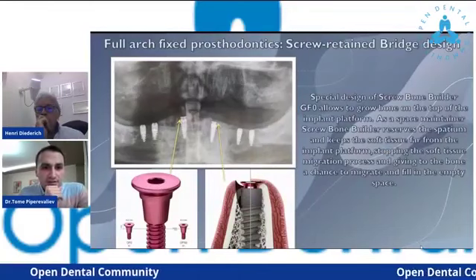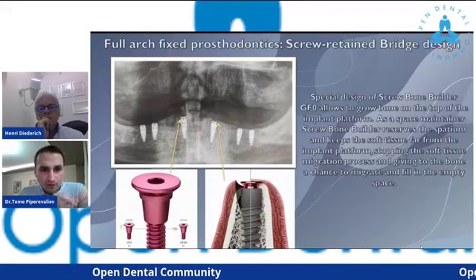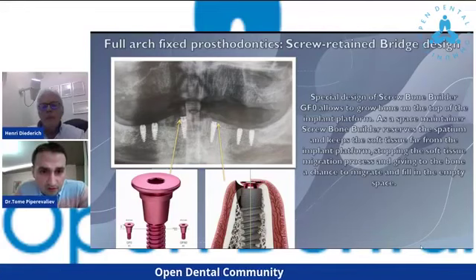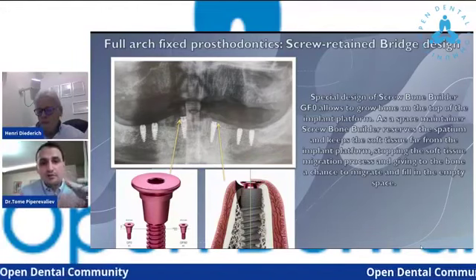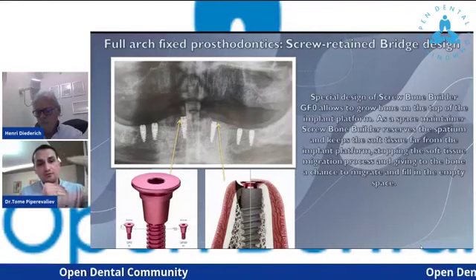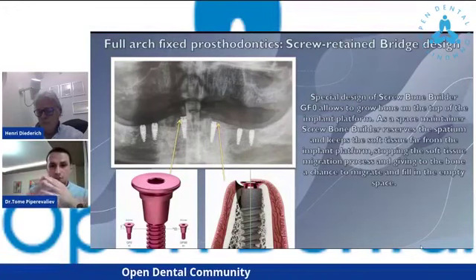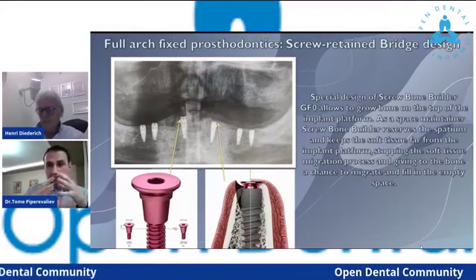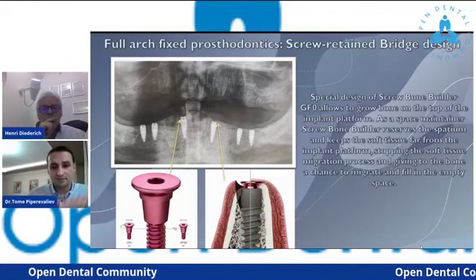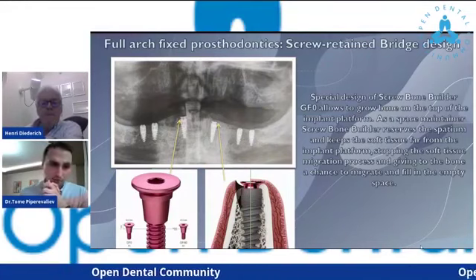In this slide, we can see the X-ray immediately after implant placement. And as I said, as we can see, we used specially designed screw bone builders on 2 implants. Those screw bone builders, or GF0, are acting as a maintainer of the space between the soft tissue and the platform of the implant. And they are preventing the soft tissue from covering the platform of the implant and give a possibility to the bone to migrate and fill this empty space. And this option will lead us to a better integration of the implants.